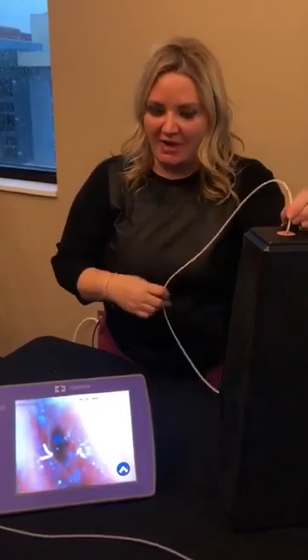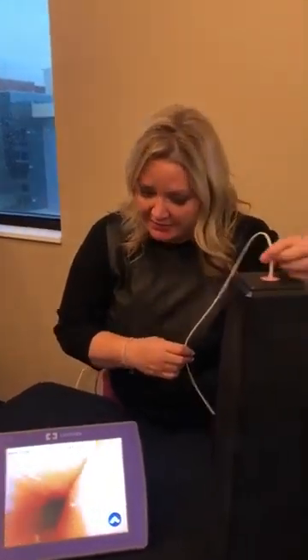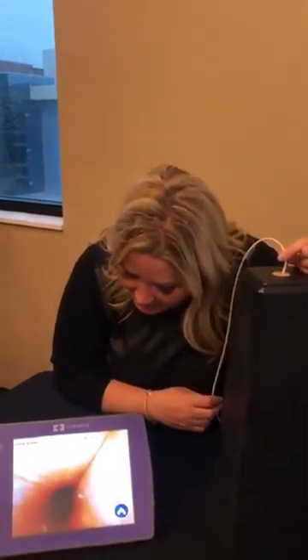So what I'm going to do is simulate placement using this model, and we're going to use the screen to identify different anatomic landmarks to indicate that we're in the right spot. I might need a little assistance because I can't completely see the screen from where I'm standing, but as we enter, you're going to see the vocal cords. What we're going to do is shoot for the esophagus. You're in there. Oh, we're in the esophagus, nice.